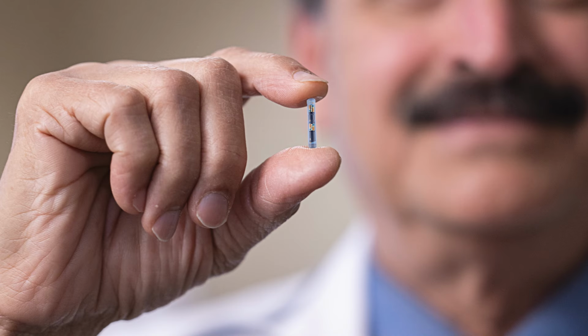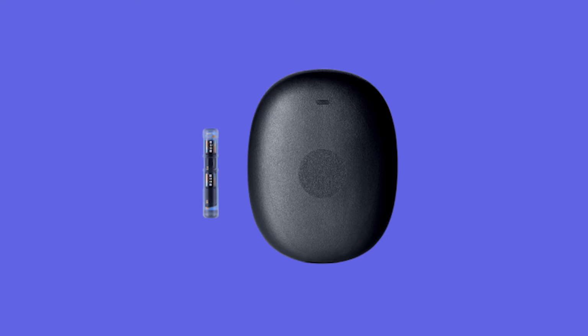So what we've been working on is making the sensor as invisible as possible to the body, right? As I said, one of the things we've done is the surface, quite frankly, is a contact lens material, right? Very inert. They're very biostable. You can see through them, right? So they have great optical characteristics. And the trick we've been doing for the past decade is trying to make the surface of that sensor look as much like water as we can. Because what do you know is biostable and biosuccessful? Water in the body, right? So that's what we've been working on in simple terms.